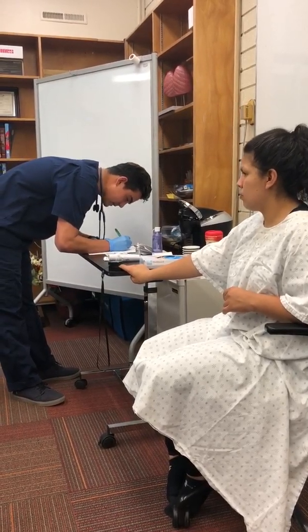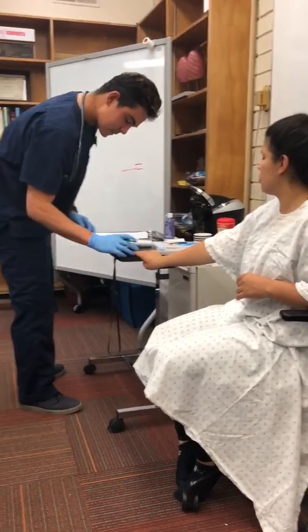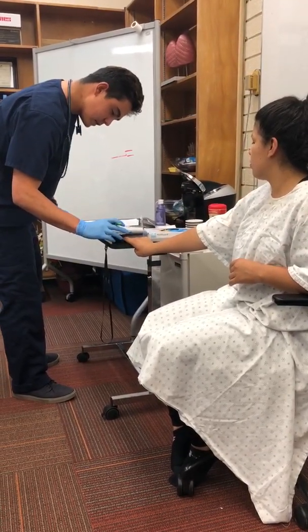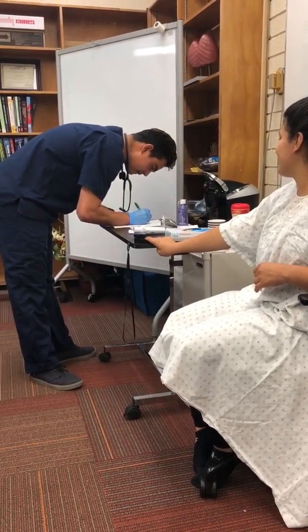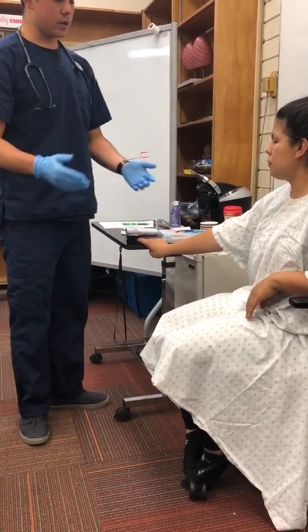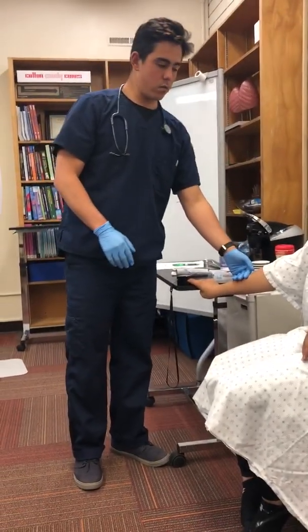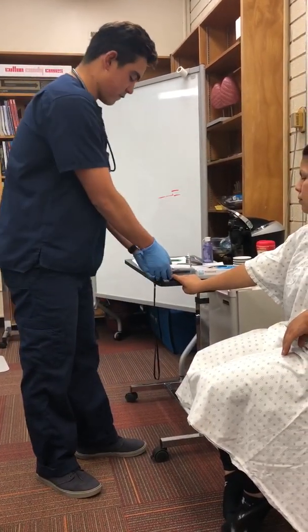Pre-heart rate is 64, respirations are 20. SpO2 is 98%. Okay, and skin signs right now, good, no cyanosis, warm to the touch. Okay, I'm gonna go ahead and take this off for right now.